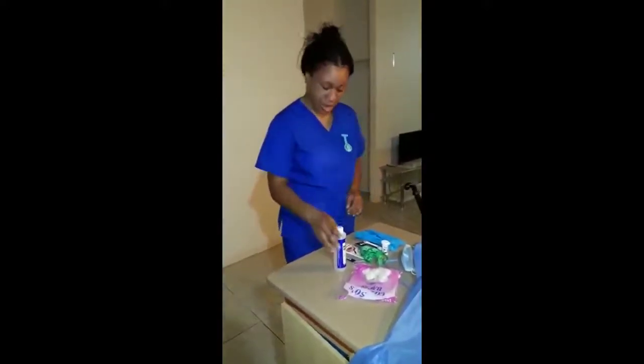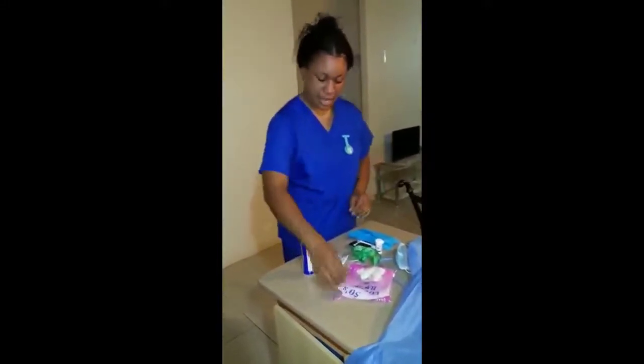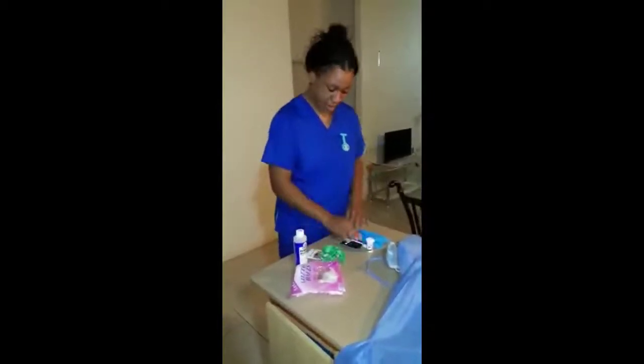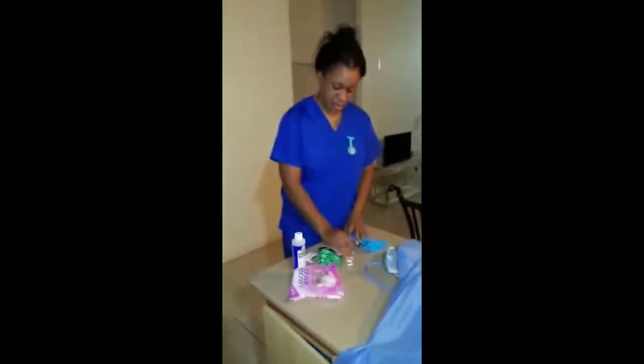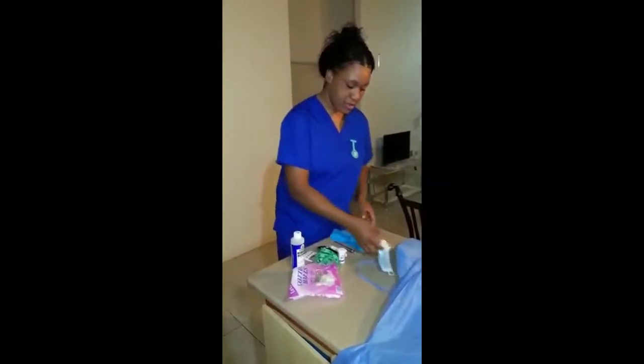The equipment needed for this assessment are rubbing alcohol, a book and a pen, some cotton balls, a tape measure, a glucometer and some test strips, a pen light, a pair of gloves, a mask, and a gown.